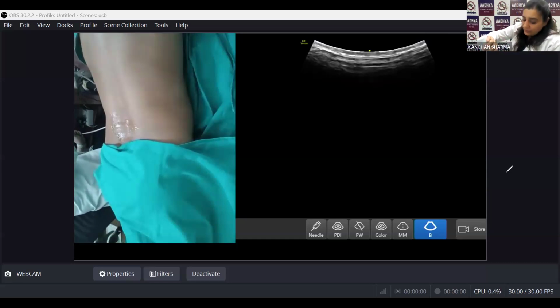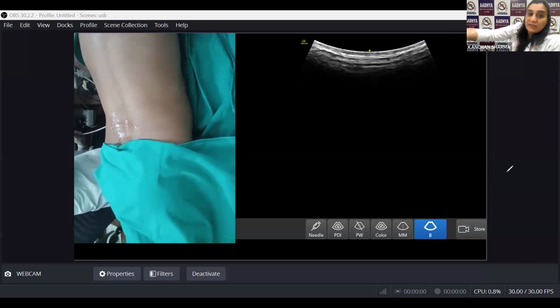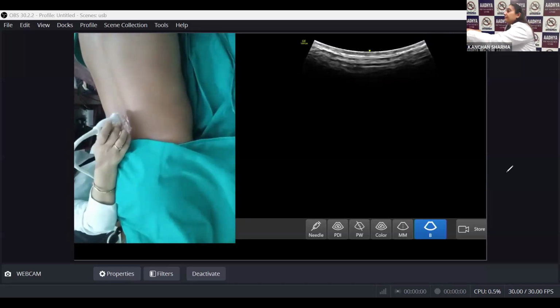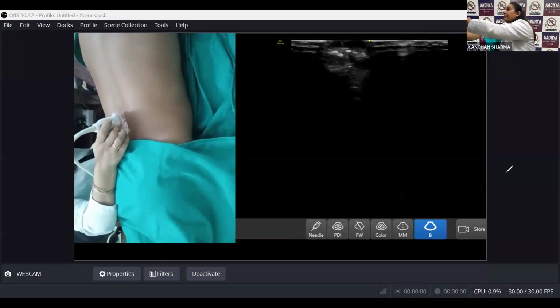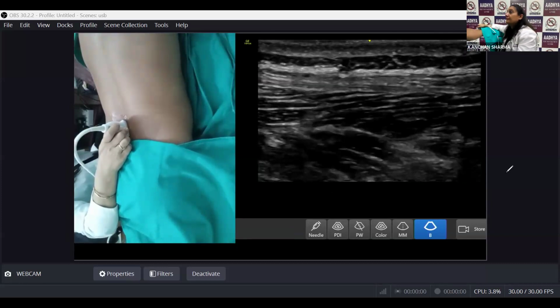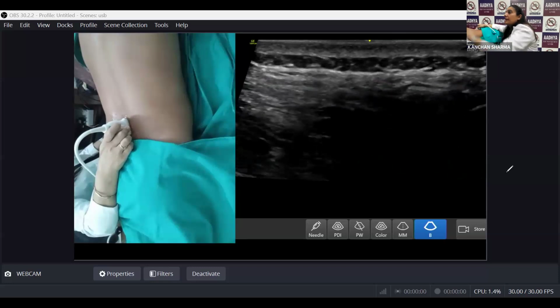Keep practicing whenever you are giving spinal anesthesia. You can give it USG assisted. It means you identify the spinous process, the interspinous area, and then you start giving your lumbar puncture. Okay, so I will now change my probe, and I'll reduce the depth also, because I don't need that much depth. I'll go to virtual convex. Fine, right? Let me increase again a bit.